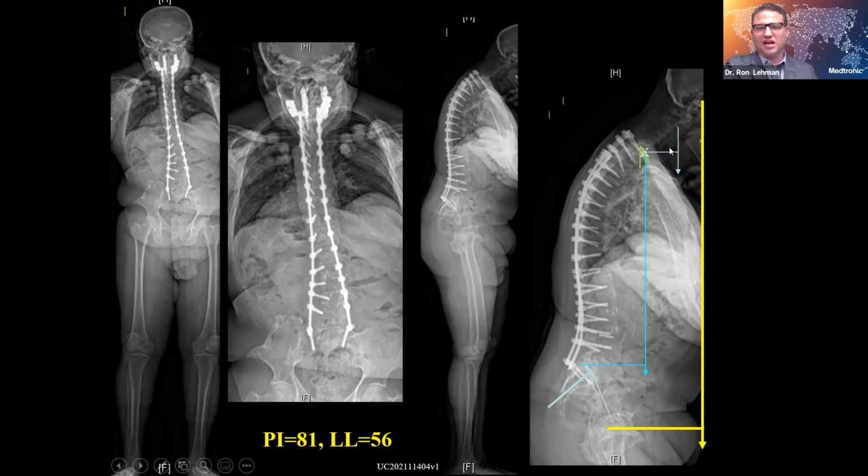So when we look at the rods, we often look at this and say, well, that doesn't look too bad. It's got to be a cervical problem because his head's hanging off. We look at the lumbar spine, we look at the rods, we're like, they have some lordosis there, so it's probably not that. But we really have to differentiate looking at things like TPA and the CTPA as well to say, is this a cervicothoracic problem, or is it a lumbosacral problem, or really is it the rare hybrid where it's both? And so in this particular case, I thought it was both.